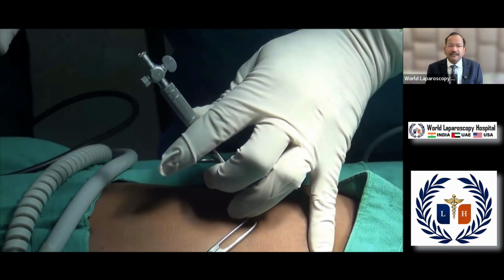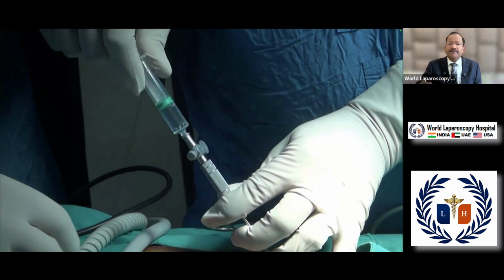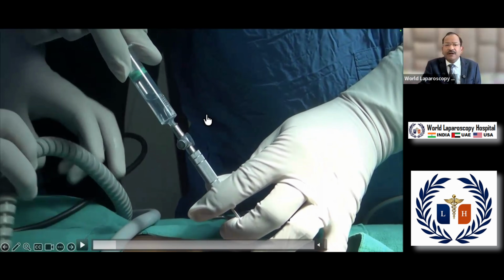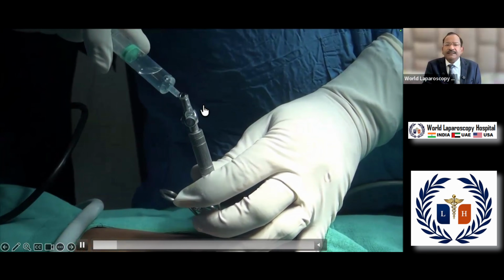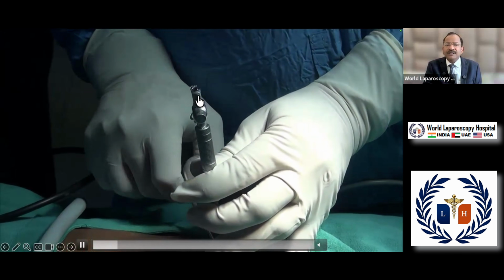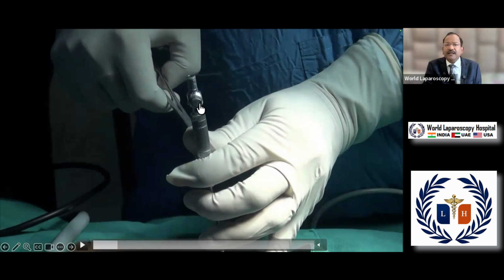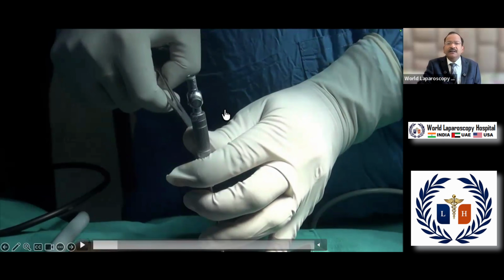After that you will attach the tubing. Before that, this is the irrigation test, this is the suction test: nothing is coming, only a bubble is coming. And this is the hanging drop. Look at this, this is the hanging drop. Once you lift the abdomen, this hanging drop is sucked in. You can see it is sucked in. That means you are inside the abdominal cavity, because as soon as you lift the abdomen, a negative pressure is created intra-abdominally and it will suck this in.